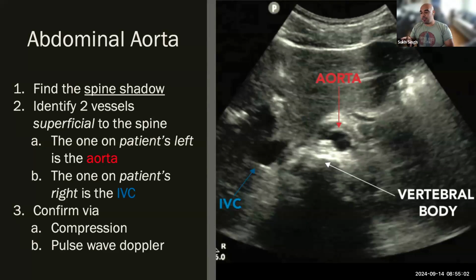Lainey, it's funny you mentioned it, like in normal anatomy. I've only seen this once, and it was in a medical student, this normal variant, but his aorta and IVC midway through flipped and reversed. Wow. And I was like, I've never seen that before. And the whole time I kept thinking that I have the probe backwards. But it happens. So maybe we'll find someone else with abnormal anatomy during our lab.